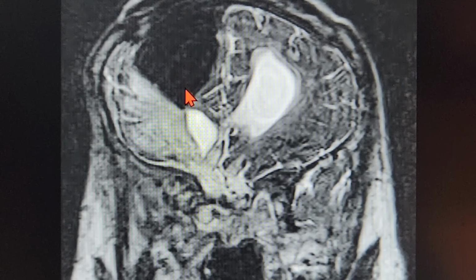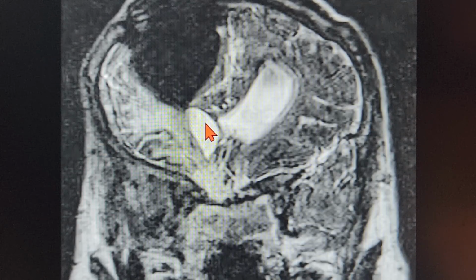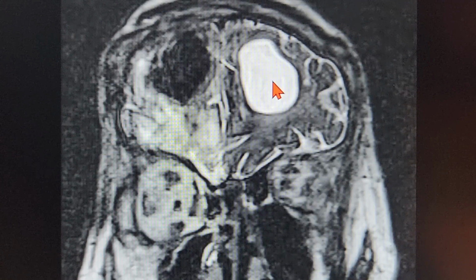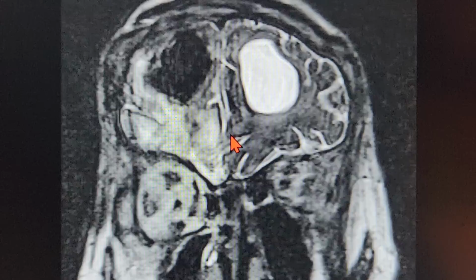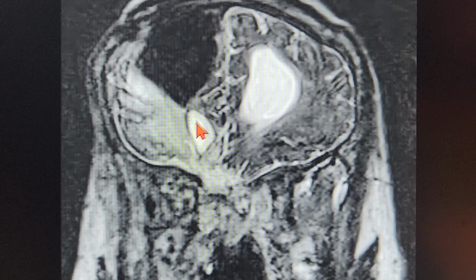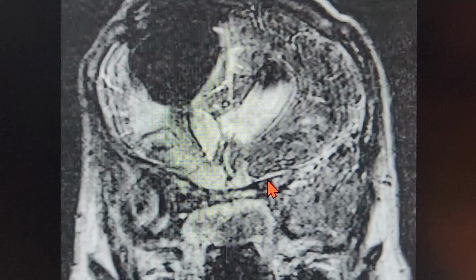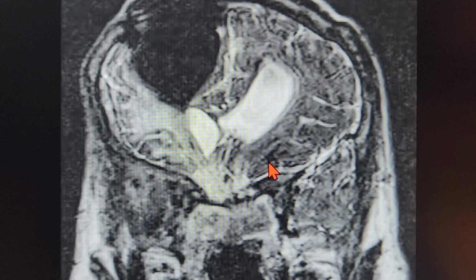And you can see the lateral ventricle on the patient's right side is completely compressed as compared to the patient's left side lateral ventricle. So I'm going to go anteriorly. See, that's the lateral ventricle of the patient. It's completely dilated. The patient has hydrocephalus, and as we go behind, that's the patient's right lateral ventricle basically. And you can see because of the air foci superiorly, it's kind of pushing the lateral ventricle on the inferior aspect. We're going to go behind. That's the MRI I have, the best one I can say for sure.